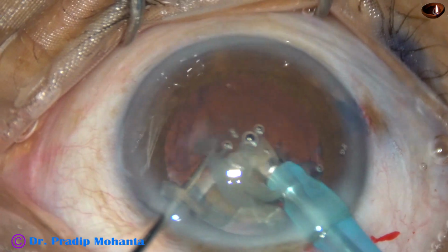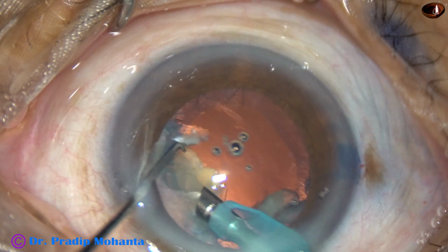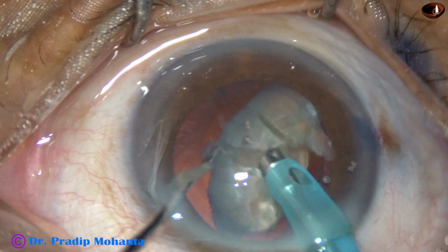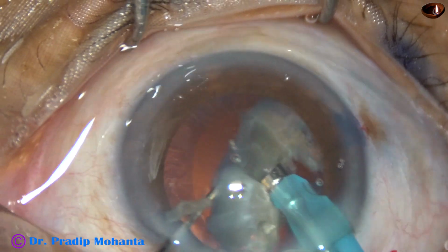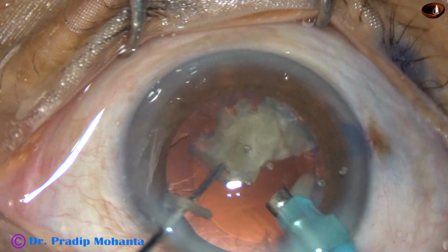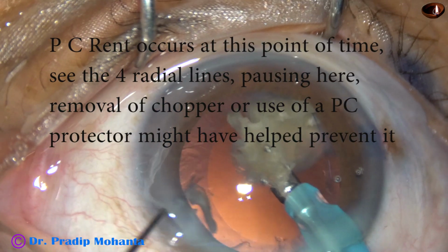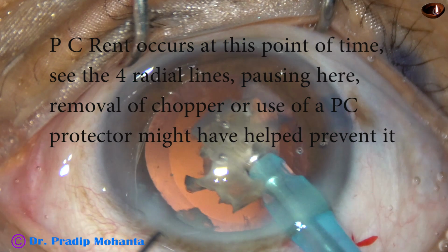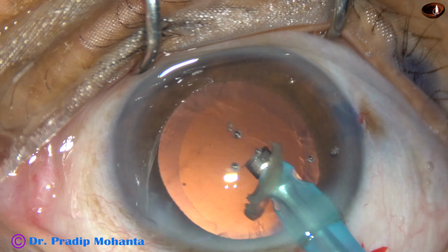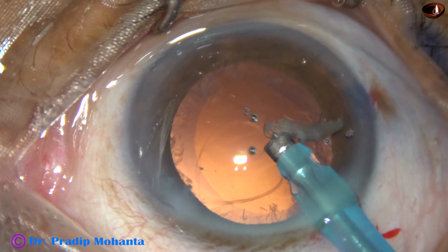This is okay. This nuclear part is free, and now see the tricky portion. This part is quite big, and there is no epinuclear support. Posterior capsule is very close. In such cases, I could have used a posterior capsular protector, PC protector, which I have devised, but I didn't use that, and here it is. PC rent occurs, and it is quite big.